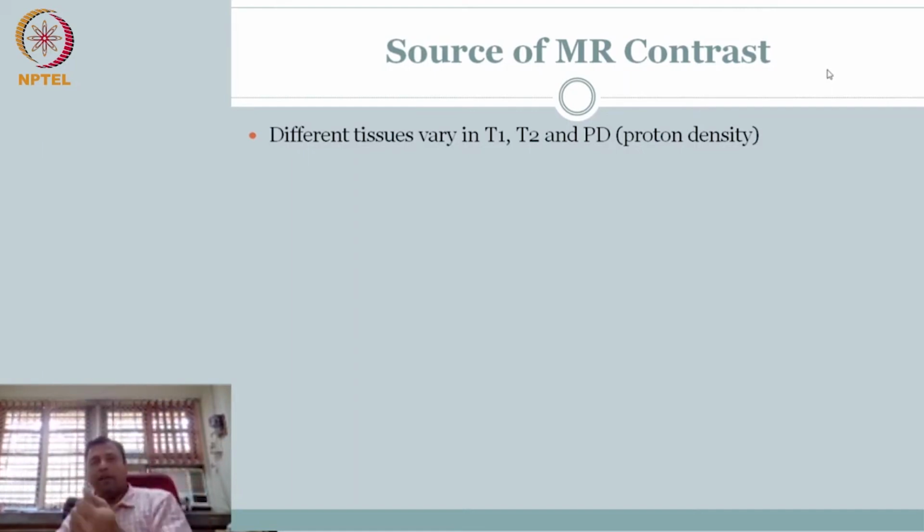So alpha is one parameter that you can control, depending on which the signal you are measuring might be different. Okay, so alpha is under your control. Last class we talked about one other thing: after you push it, you can allow it to dephase, and then I can do an echo.